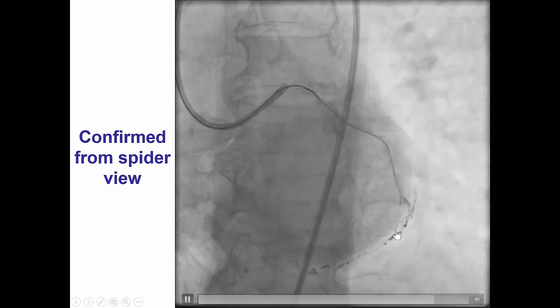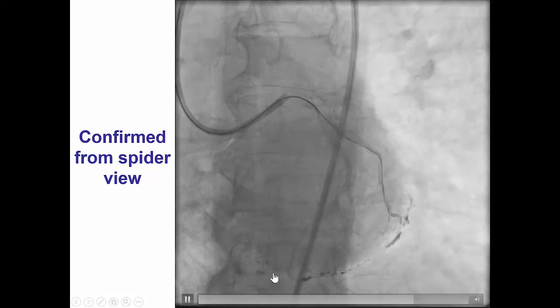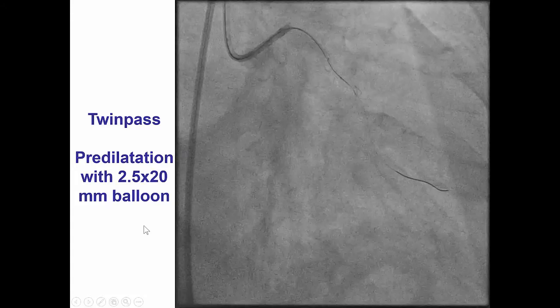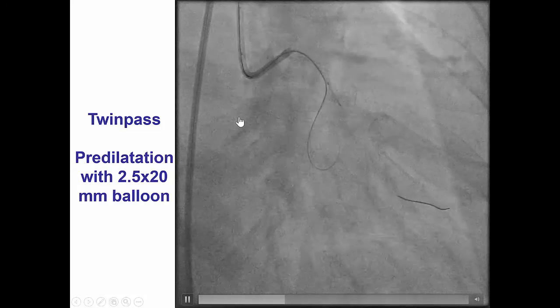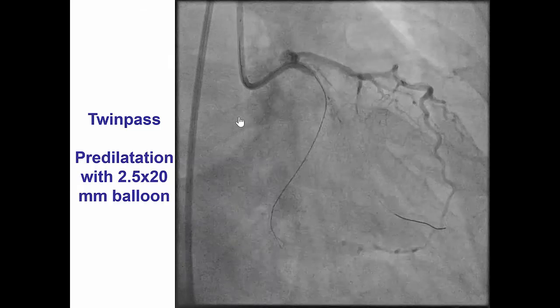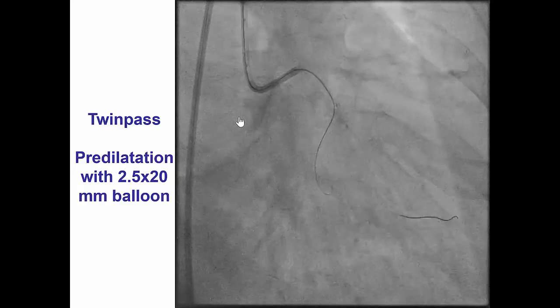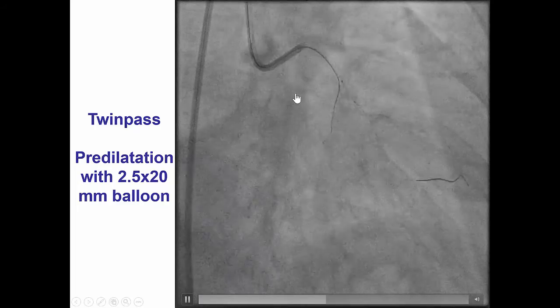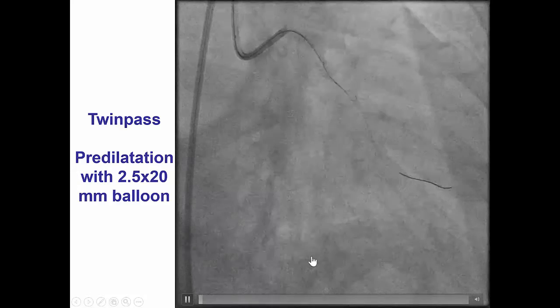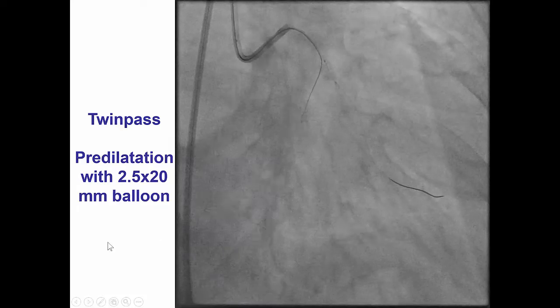So we do have successful distal re-entry. However, we still need to wire into the distal circumflex, which is very large since this is a left-dominant system. To achieve this while minimizing the risk of dissections, we used a dual-lumen microcatheter — the Twin Pass — and were able to advance a guidewire through the Twin Pass to the distal vessel. However, there were some challenges, and during injection there is some staining in that area and a little looping of the wire, which would be important to remember for subsequent injections.